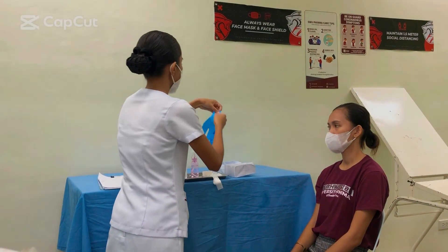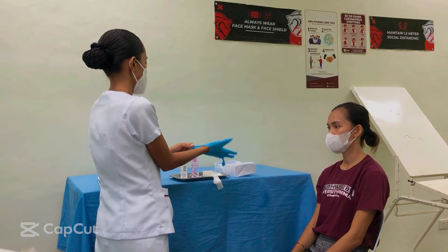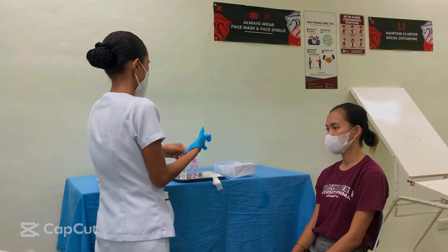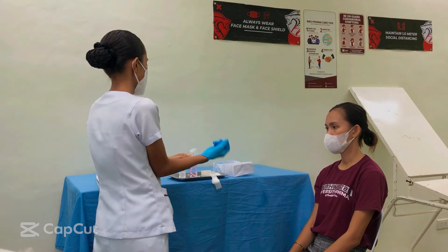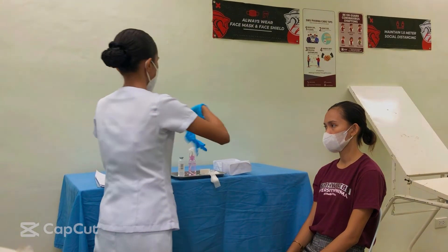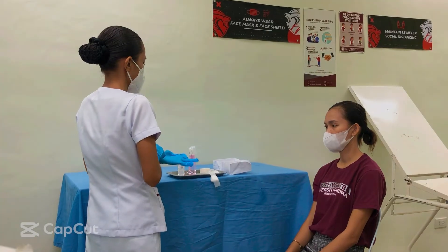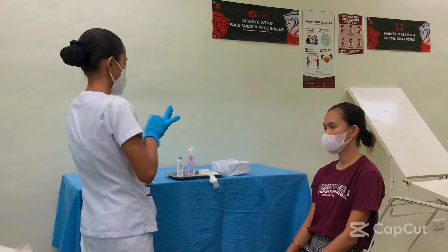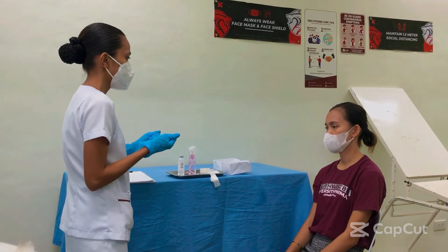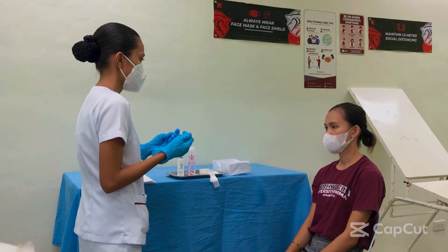Apply clean gloves. Note: if the patient has a latex allergy, use latex-free gloves. Select the appropriate injection site. Inspect the skin surface over the site for bruises, inflammation, or edema.